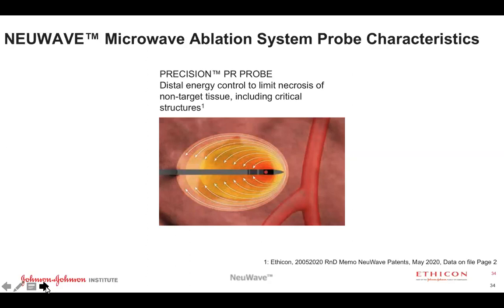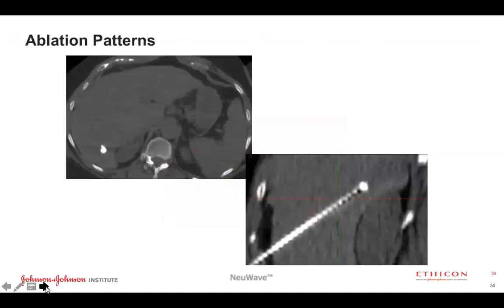And the reason why that's important is because you really want to skewer your lesion. You want the tip of the probe to go through the lesion if that lesion is a small one, say 1 to 2 centimeters. Obviously, if it's a bigger lesion, 3-4 centimeters, then you're going to need the entire width of that ablation zone, but you want to take advantage of where the width of the ablation zone is, where you position that probe. So here's an example early on in our experience. Tiny little lesion. You can see it's very dense because of the lipiodol deposition from prior chemoembolization, but I use this because it's a nice illustration of the phenomenon I'm trying to explain. So there's a tiny lesion.